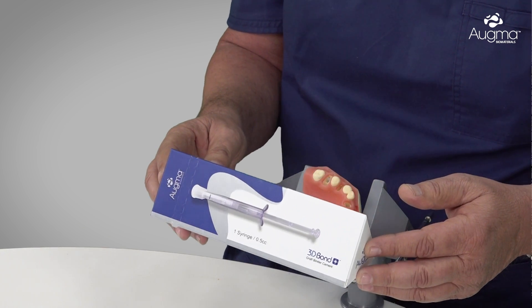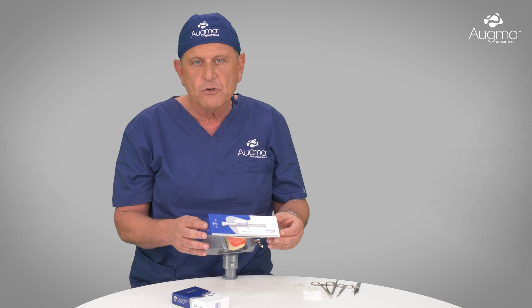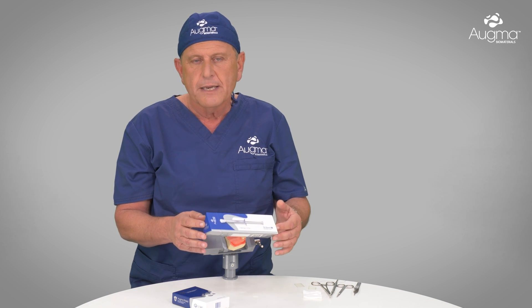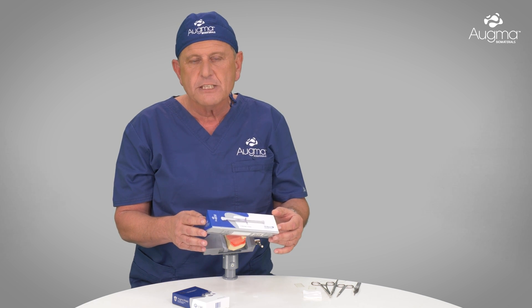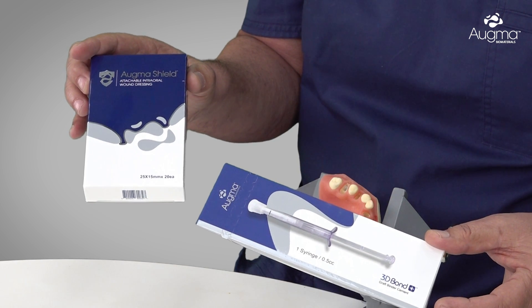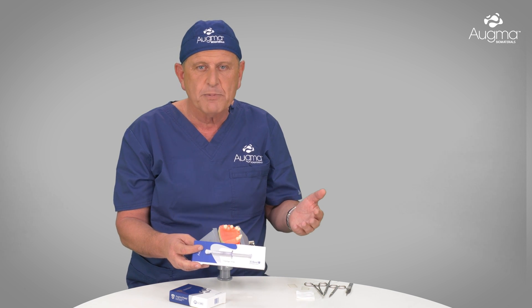The 3D Bond Plus is a pure biphasic Calcium Sulfate that comes in an all-in-one syringe and is intended to be used for socket grafting — for example, we inject it into the socket and later protect it with the Augma Shield. In socket grafting, we have two protocols: one is with flap reflection and the other is without flap reflection. We use the protocol without flap reflection in all cases where we have a four bony wall socket.